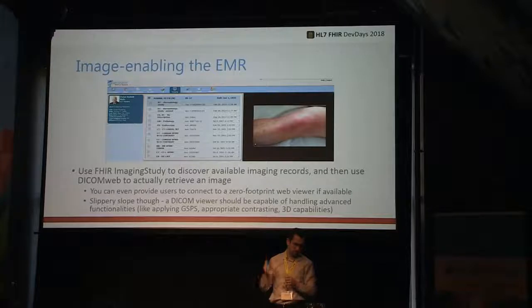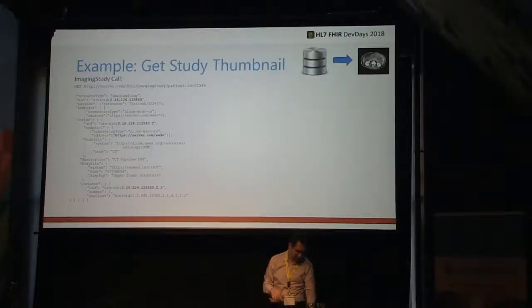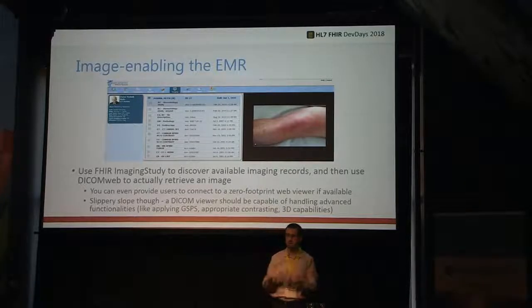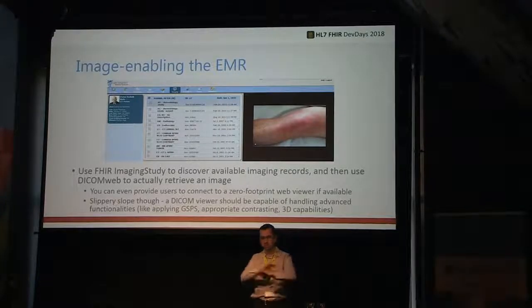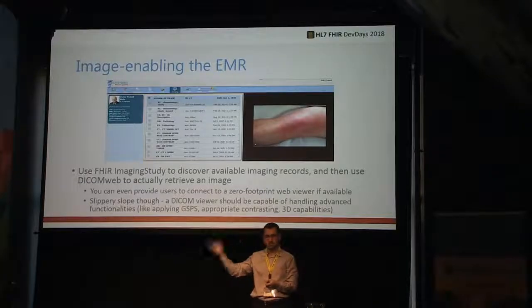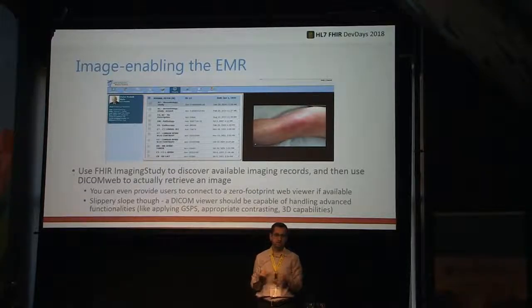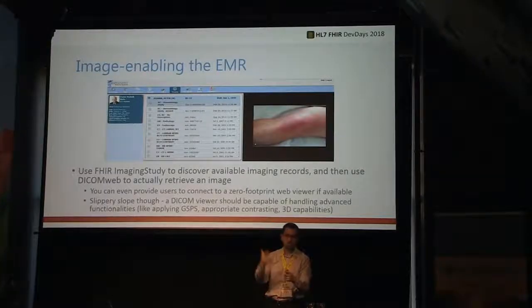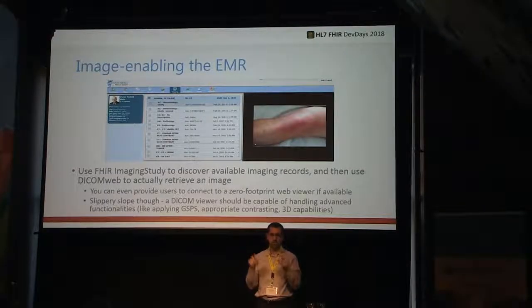Of course, the other one I mentioned is, as Brad says on his slides right here, this could be a slippery slope that you could just request the JPEGs, the rendered JPEGs, and assume that if you just put them all on screen, you're done. The reality is it depends on your target audience. If the target audience just wants a basic reference, it's probably good enough. But if your target audience is savvy enough that they'll want to work with the image, you probably want to launch it in an actual DICOM viewer, whether web-based or thick client.